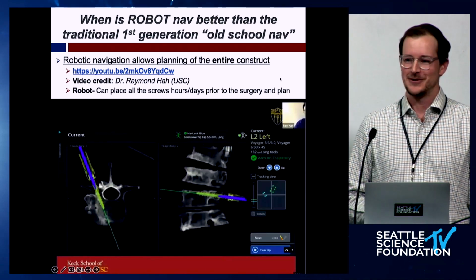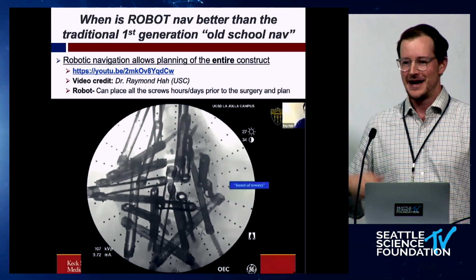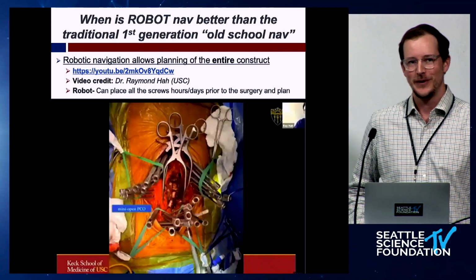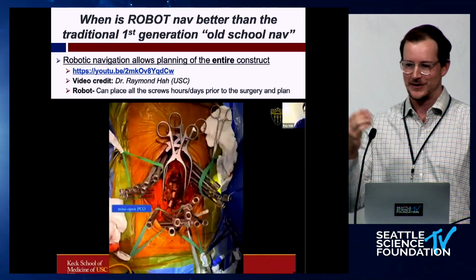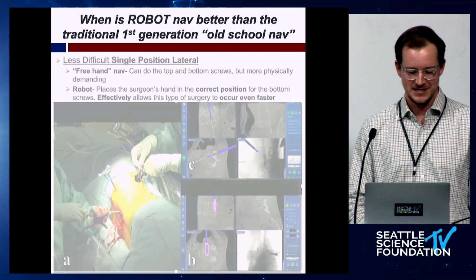So it just echoes the exact thing we were talking about earlier. I know Martin, obviously, but look at that. How do you see through that? And that's why I kept hammering you all day today. It's like, how do you see through all those towers? And this is the exact way how you see through those towers: you use the robot and you plan through, and that's how you're able to do your interbody fixation.